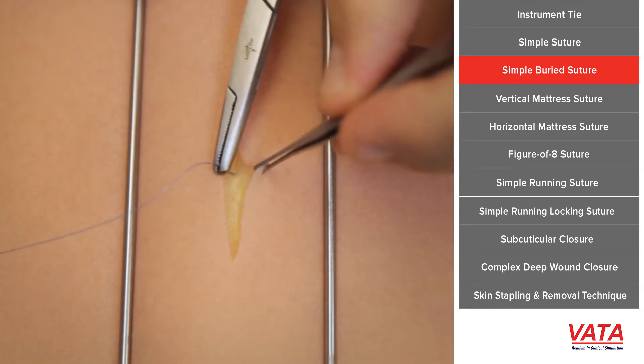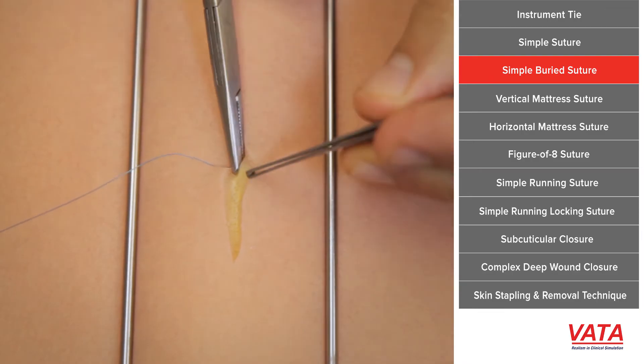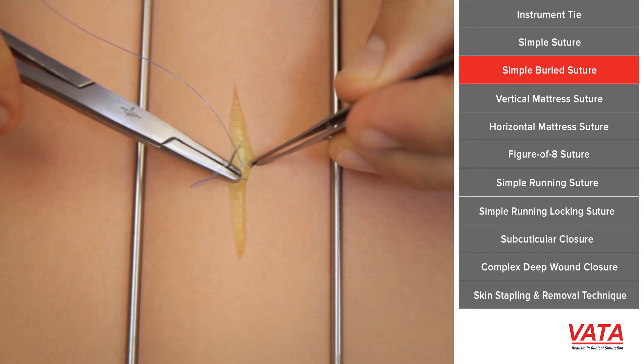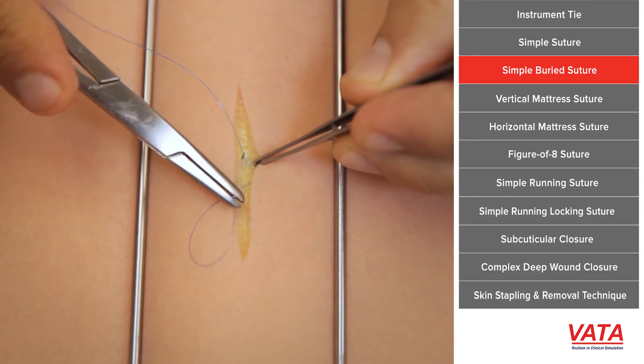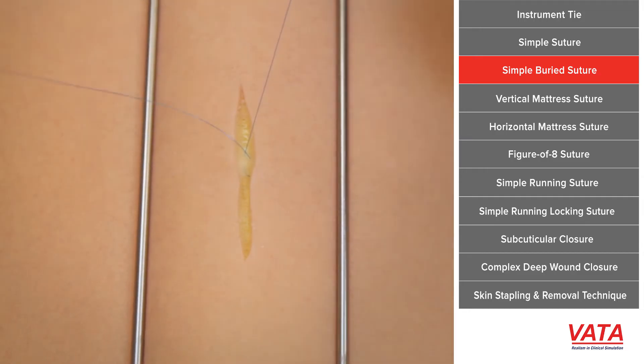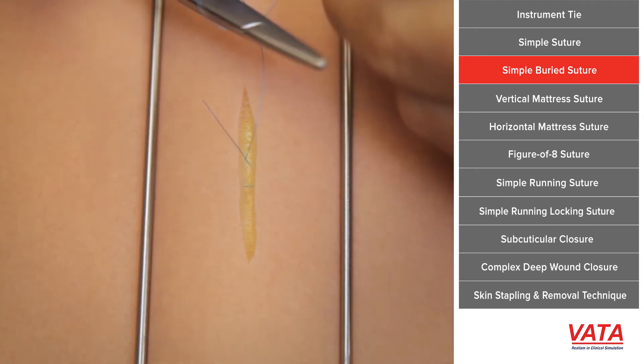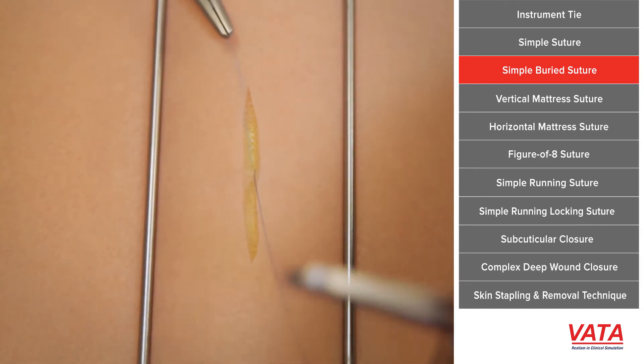The key here is you want to get some of the deeper tissues — here you see in the model we can get some of the deeper dermis. There's actually a little piece of mesh in that deep dermis. We want to grab that deeper stuff, come out superficially, so we're starting deep, and then we enter superficially and end deep. So both threads of the suture are now deep.